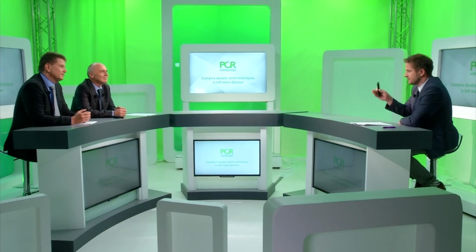I agree. The proximal size you can only approximate, it's a native vessel. So I would not do it. I would go sequentially as you do. Be also very careful with anything which might cause major dissections, because there is anyhow a certain moment when you have to rewire one of the branches, and if you have to rewire through a dissected area, then success is not necessarily 100%.